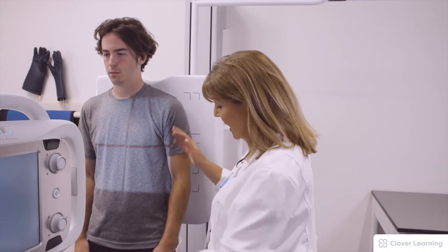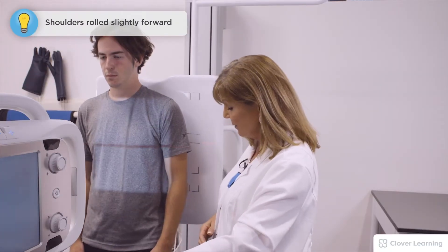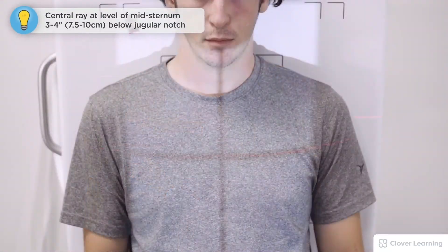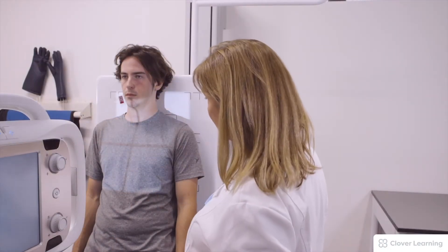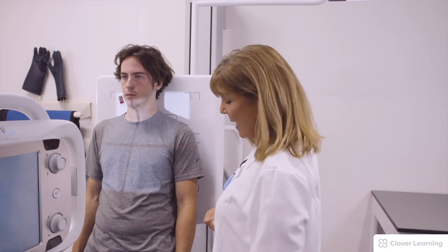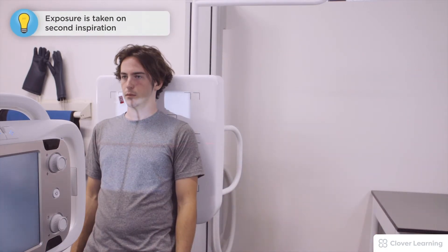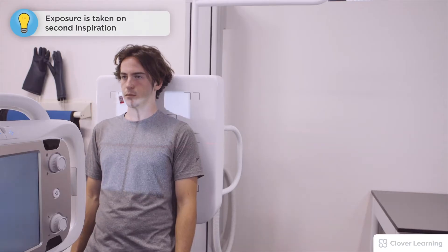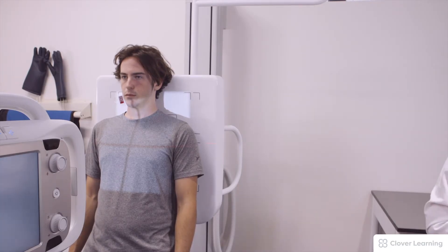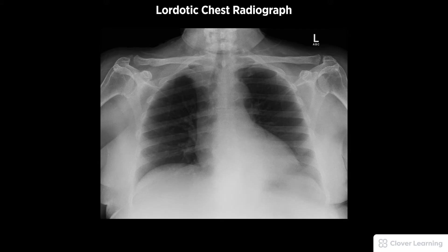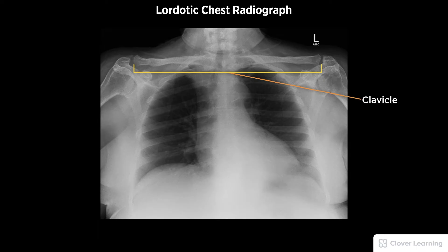I'm going to push you back and we're going to have you step out with your feet. Now we have the central ray in between the sternum. We've got a right marker on the right side. We're going to have him take in a big deep breath, blow it all the way out, take in another big deep breath, hold, don't move — and the exposure is made. A diagnostic lordotic chest radiograph should be free of motion and rotation and include the clavicles projected superiorly to the lung apices.